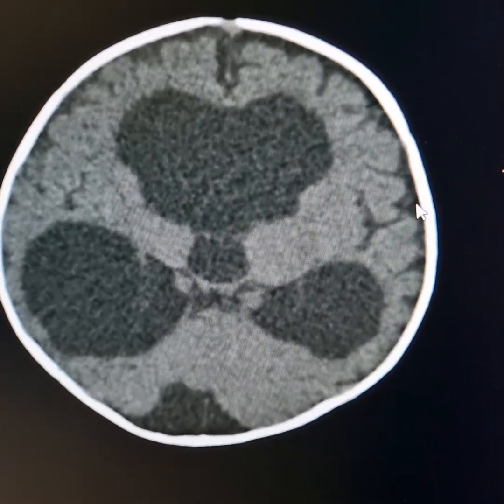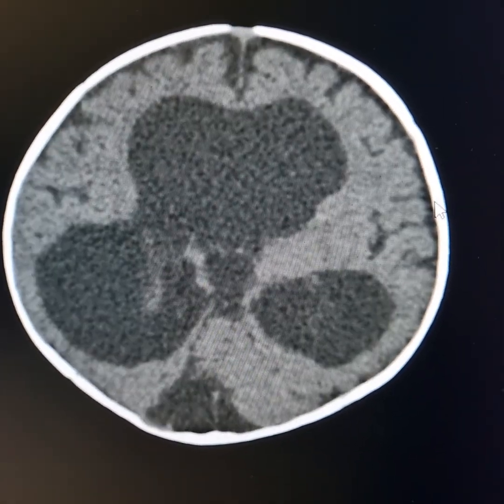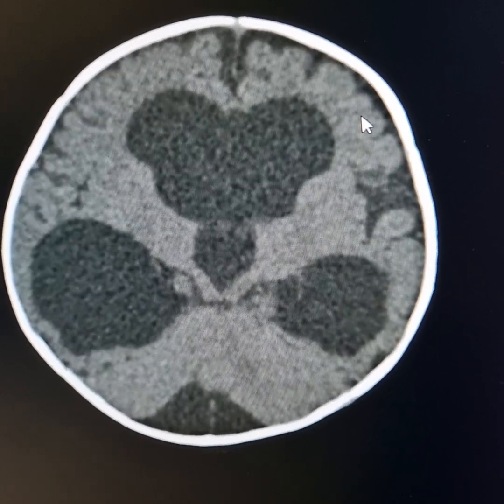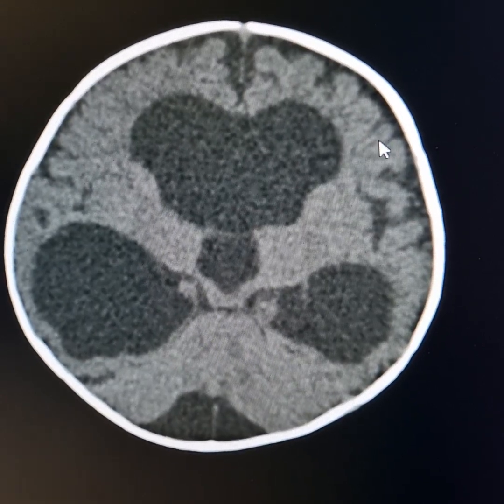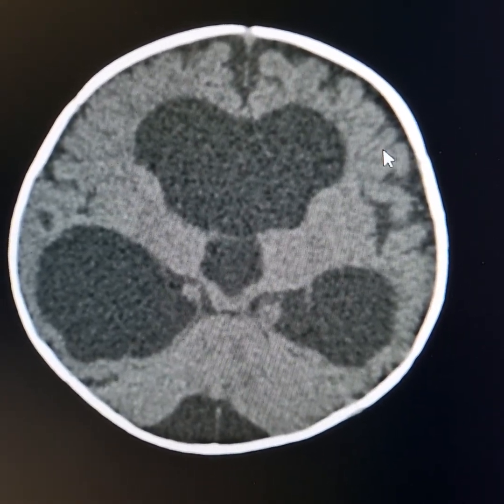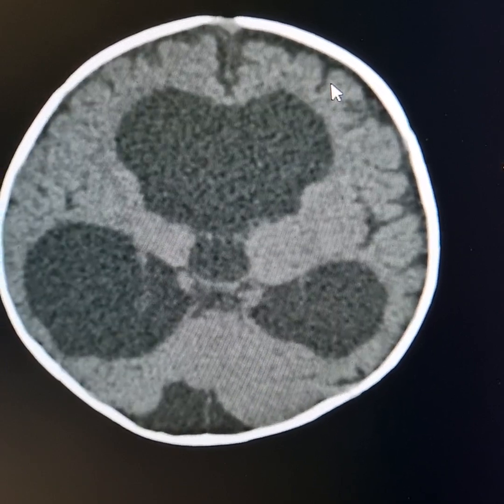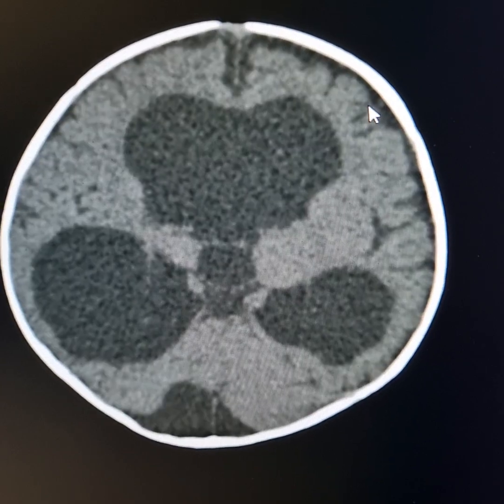One thing that needs to be considered very carefully and documented and commented upon is that there is dilatation of the extracerebral CSF spaces. Now this is suggestive of mild cerebral atrophy. The patient is unable to hold his head. Please observe the dilatation of the sulci and thinning of the gyri.